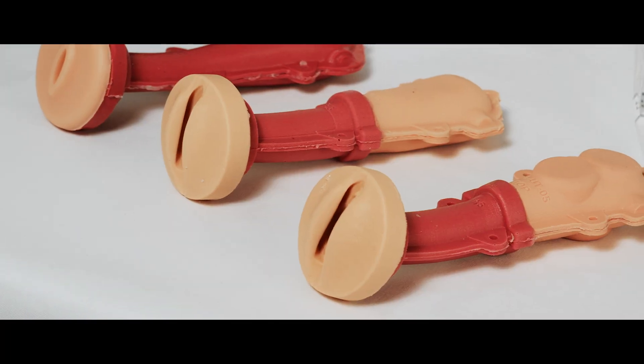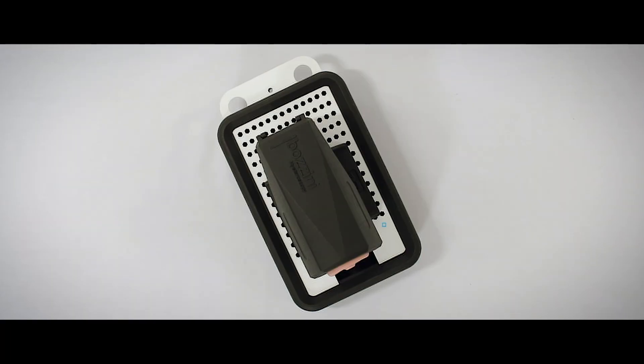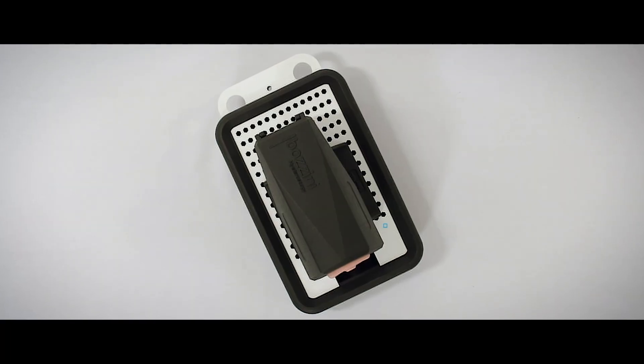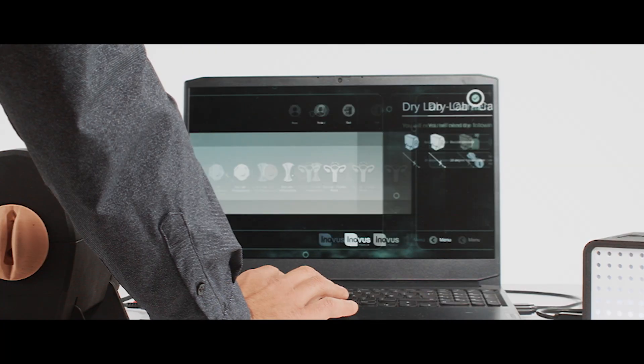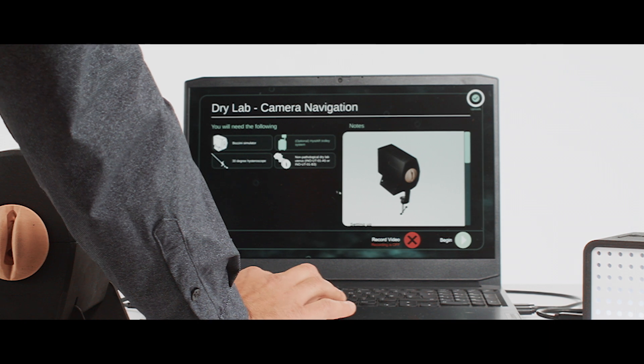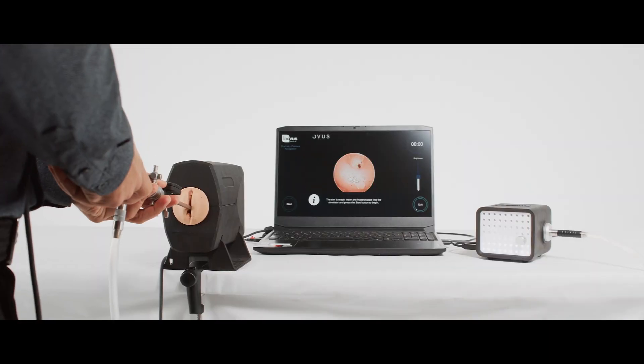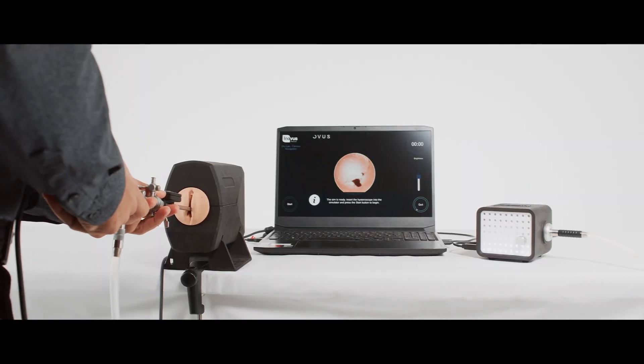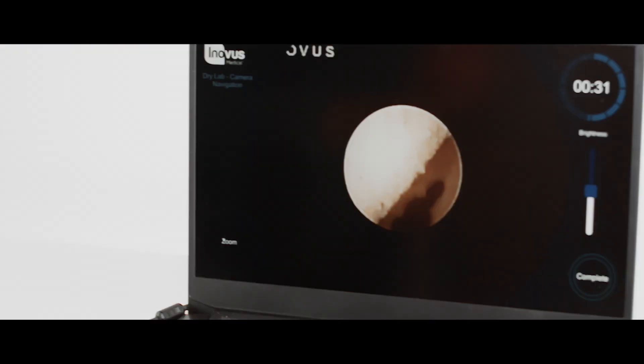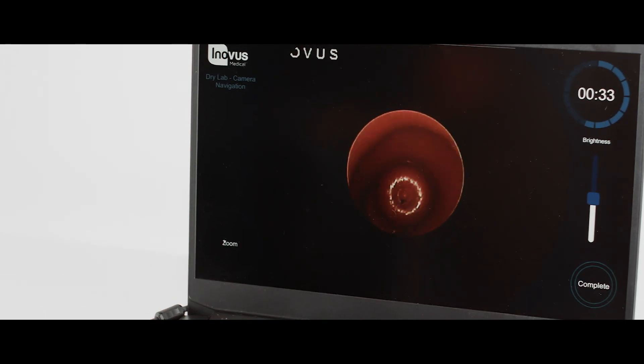With a choice of dry and wet lab models, the user can practice all elements of basic, intermediate and advanced hysteroscopy skills from an accessible distance learning setup.